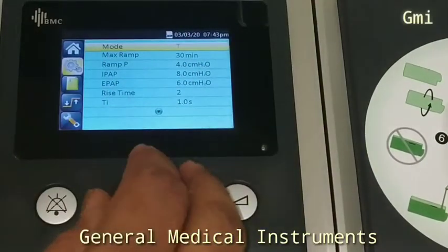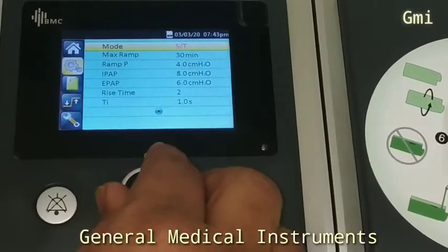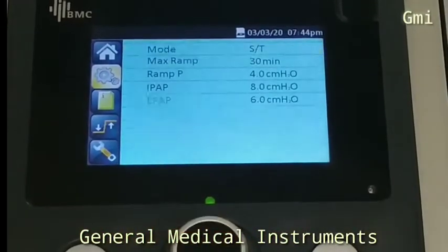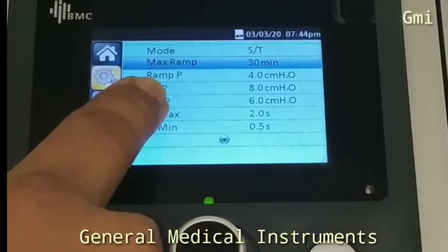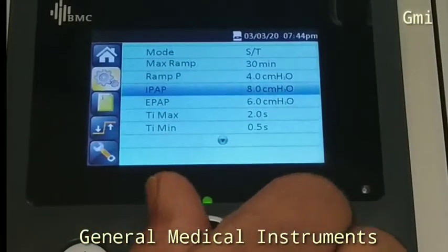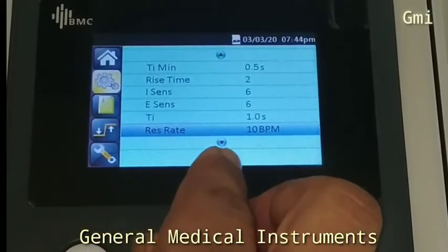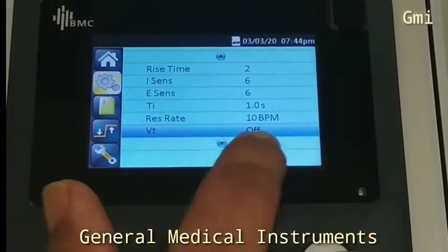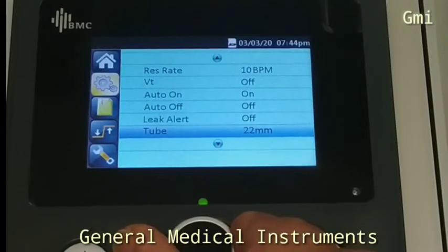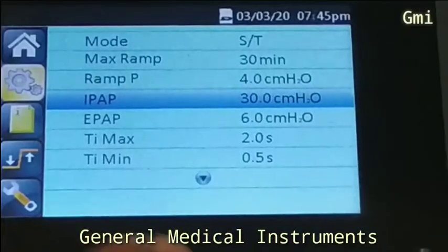Mode Selections. S/T Mode Setup. Entering Setup Menu. Parameter Setup.